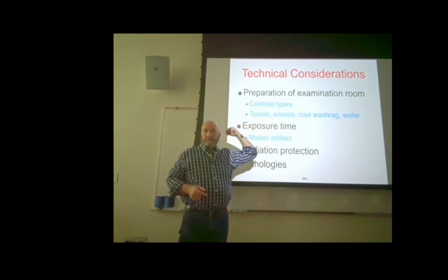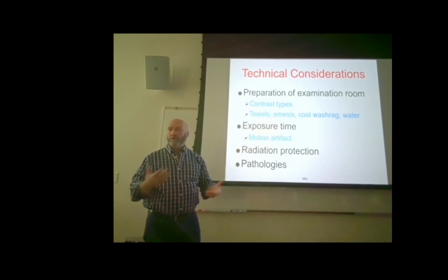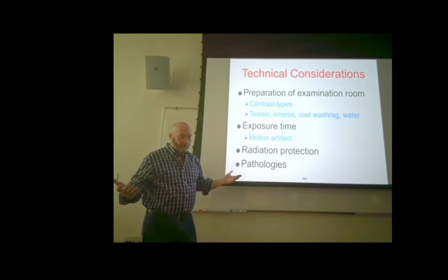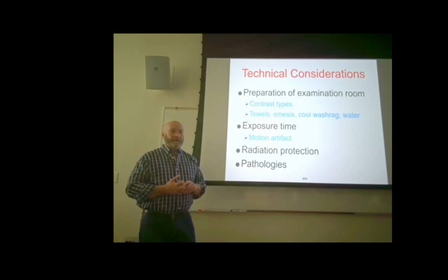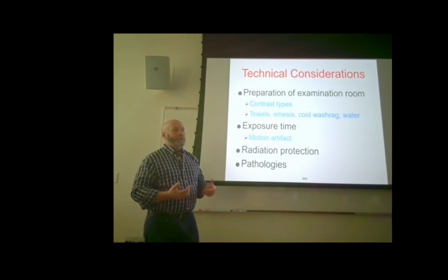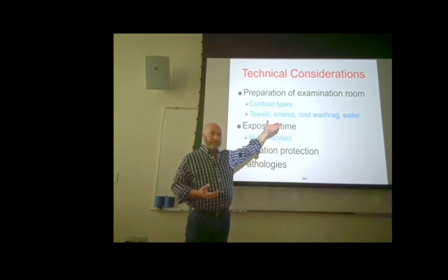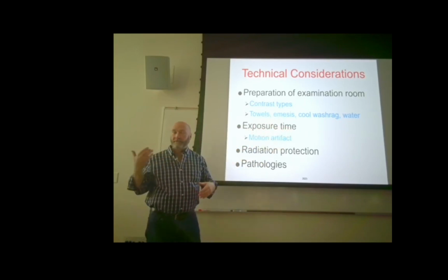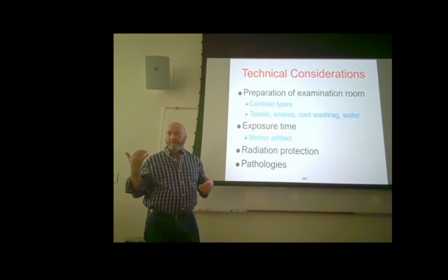All right? Because depending on the patient's pathology or their history, they may have a history of throwing up, right? So if you're standing in a room with a patient, you just gave them contrast to drink, and it doesn't sit on their stomach, and you're standing right in front of them, what's going to happen? They're going to puke on you, right? So what you want is plenty of towels to clean up, if necessary. You want wash rags so the patient can wipe their mouth. Again, the barium's very chalky and it's white, so if they drink it, they're going to want to wipe their mouth, right?